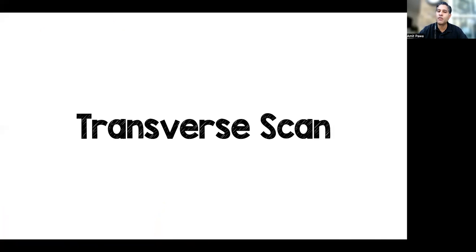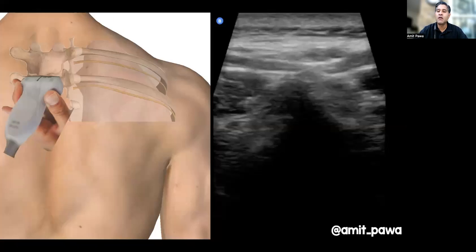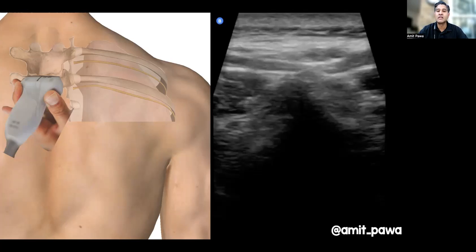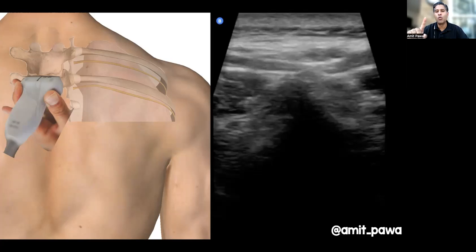What about the transverse scan? Here I've got the probe starting from the midline, scanning over the spinous process — that spinous process will be from the space above because of the way the spinous process slants down. We're going to start from the midline and scan laterally, aiming to keep the spinous process, the vertebral body, the transverse process, and the long axis of the rib all in one line to start off with.